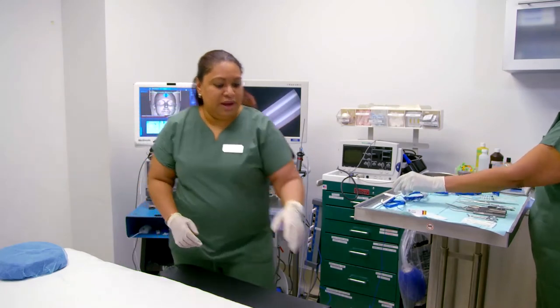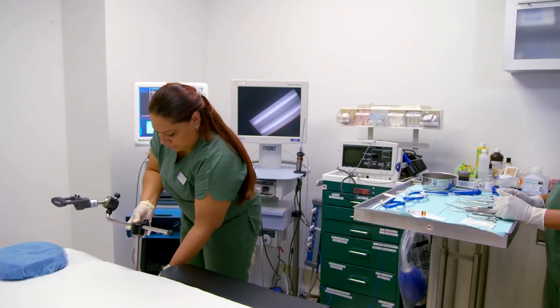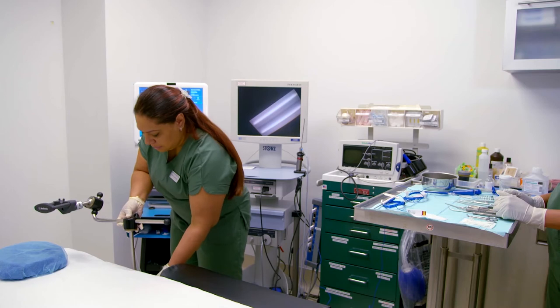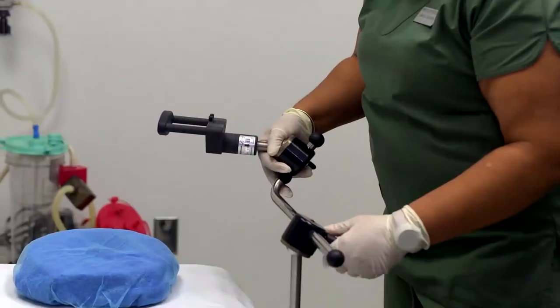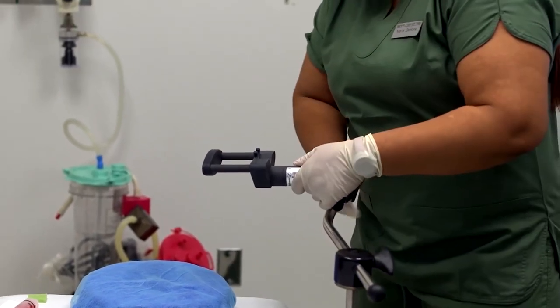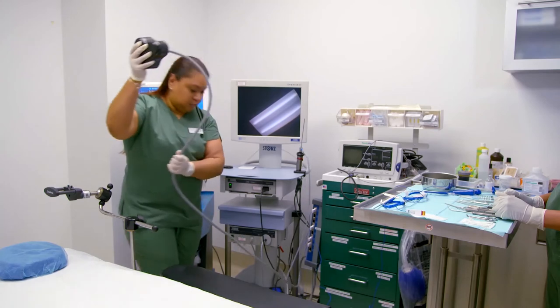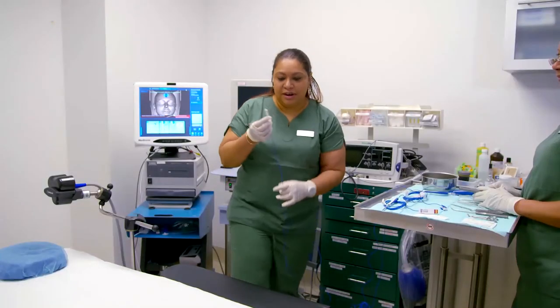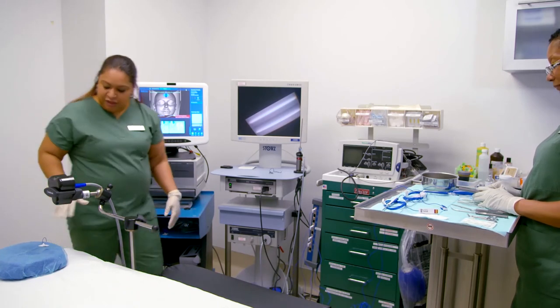The next thing we do is we put the magnet in the bed. You just gotta make sure that the Medtronic is on top. This is our patient tracker. This is gonna go on their forehead. The tracker is gonna communicate with the magnet. So we'll put it up here. When the patient comes in, we'll put it on them.